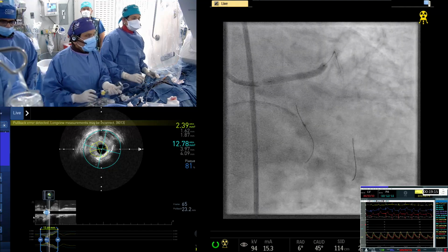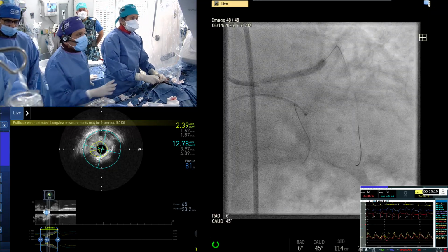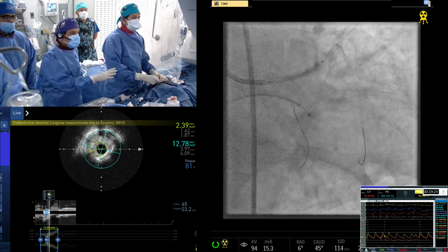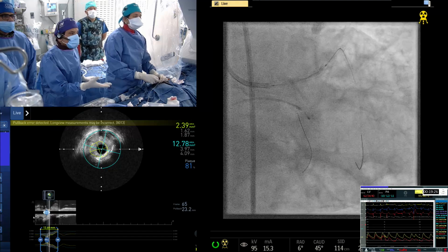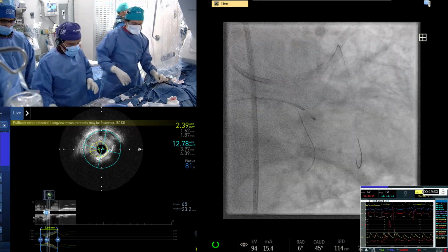With the Zions, the 3.5 and 4 is the same platform. Yeah, Dr. Sharma? Exactly, the same platform. But remember, the question is the platform is the same, but the balloon is different. No, we understand. But what we are saying is, when we are post dilating, will it give us good results?